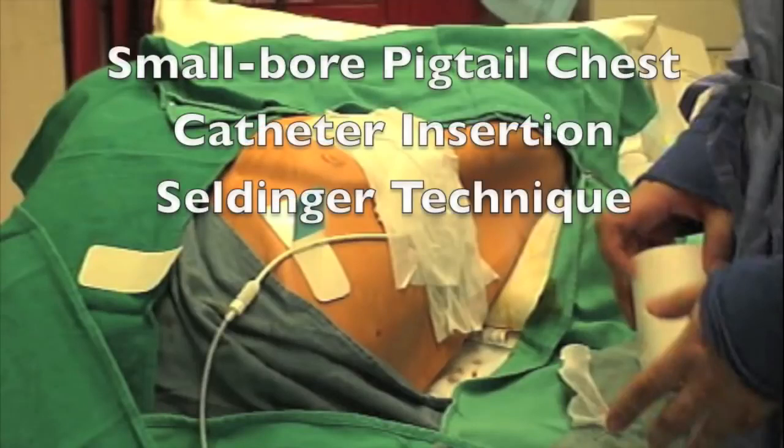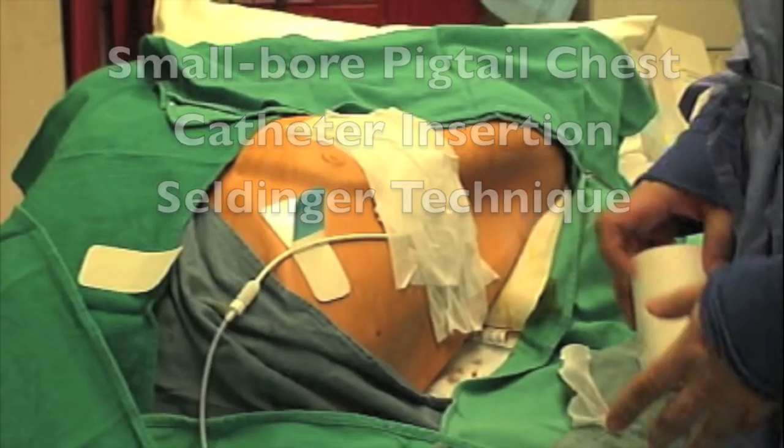This video will demonstrate the insertion of a pigtail catheter using Seldinger technique for a spontaneous pneumothorax. Please refer to the Infonet website under Pigtail Pneumothorax for the complete written protocol, nursing orders, and written insertion instructions.